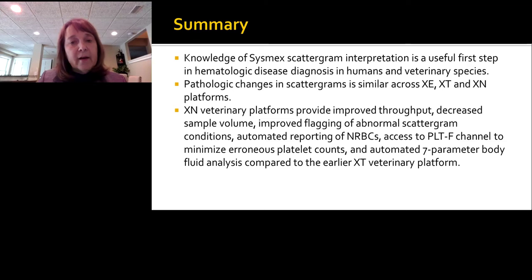We pointed out that although they're morphologically similar, white cells vary between species. So they can have different sizes, different shapes, different granularity. And these subtle differences allow the cluster designations to vary sometimes substantially. So because of that, having an accurate differential is important. Equally important for having accurate cell counts, because the sizes of platelets and the sizes of red cells vary largely between species. So it's absolutely essential for accurate counts and accurate differentials.